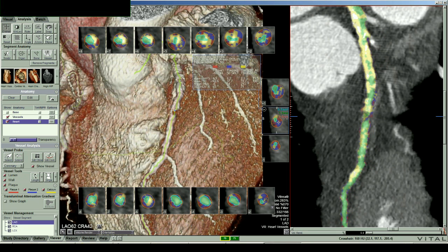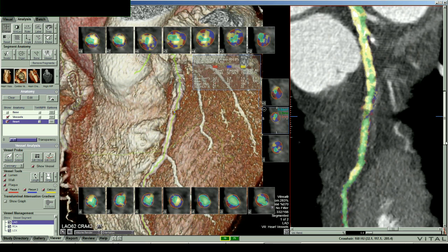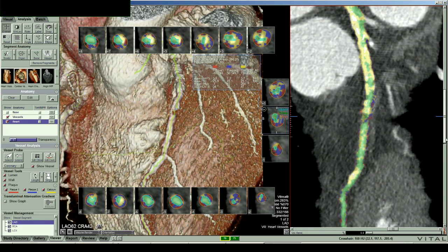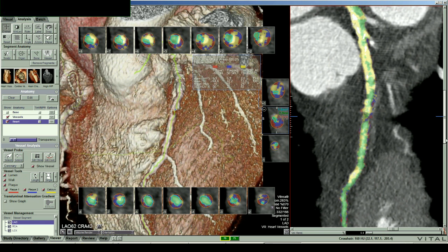And so here you can see the necrotic core is 42.6%, and we can move it along to here, and it's 37, 42.6, 44.8. So we still got a lot of necrotic core there, and we have an occluded vessel.